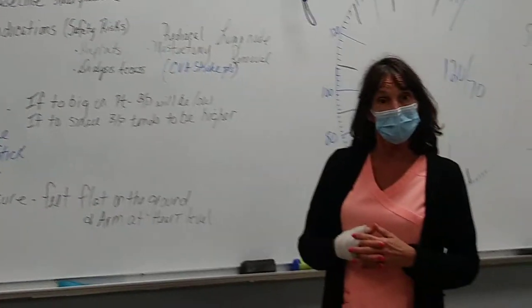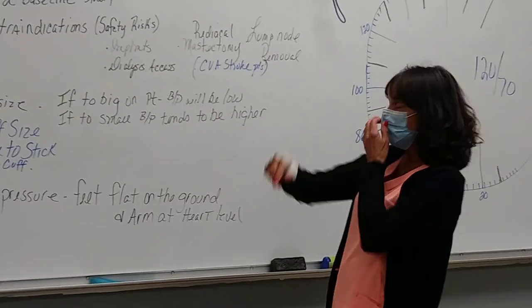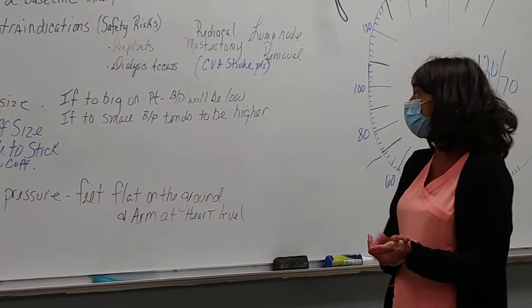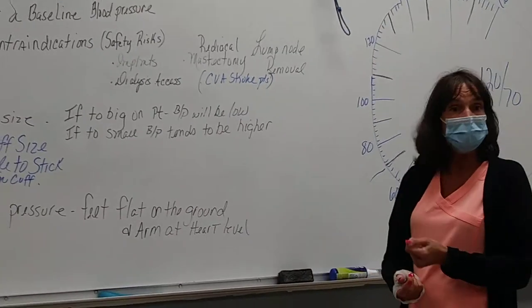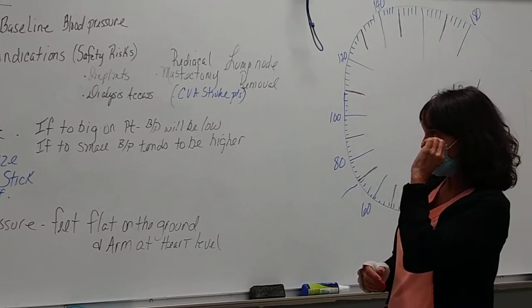The correct cuff size is extremely important when you're obtaining a blood pressure on a person. If the cuff is too big on a patient, the blood pressure tends to be lower. If the cuff is too small on your patient, the blood pressure tends to be higher. So the fitting cuff is extremely important for your patient.